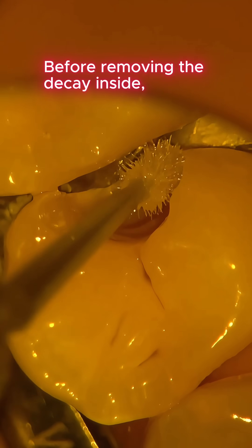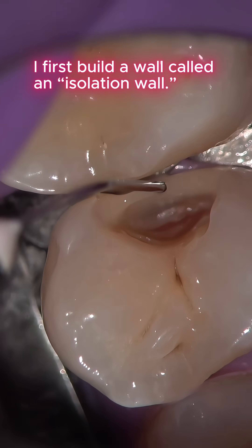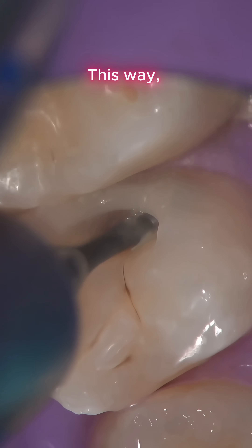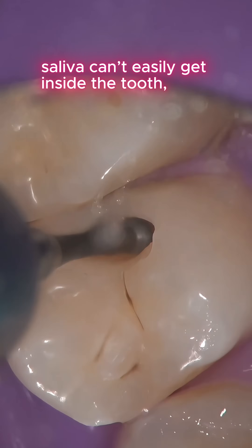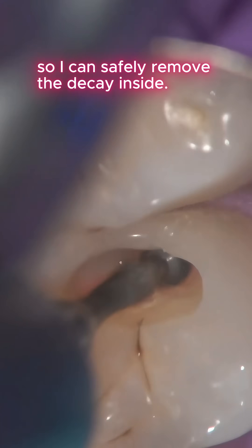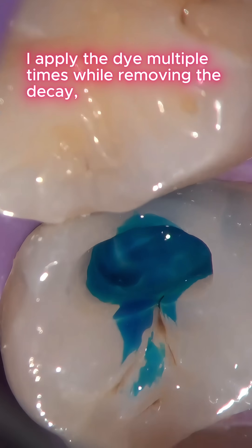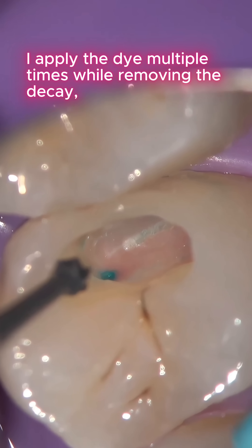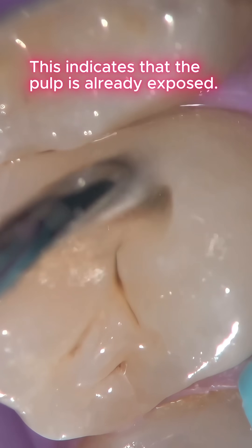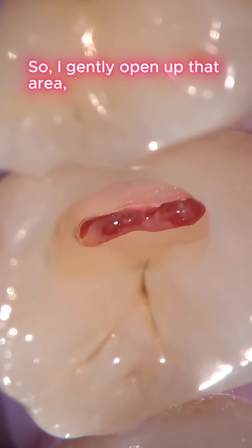Before removing the decay inside, I first build a wall called an isolation wall. This way, saliva can't easily get inside the tooth, so I can safely remove the decay inside. I apply the dye multiple times while removing the decay, and then I notice a small spot stained blue. This indicates that the pulp is already exposed.